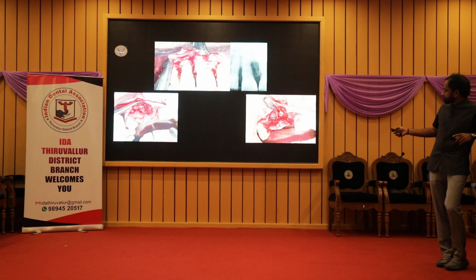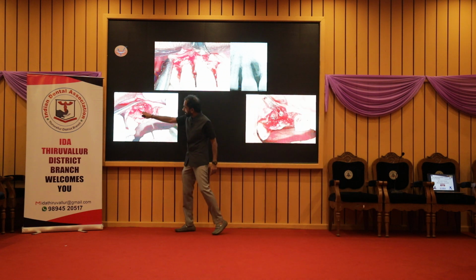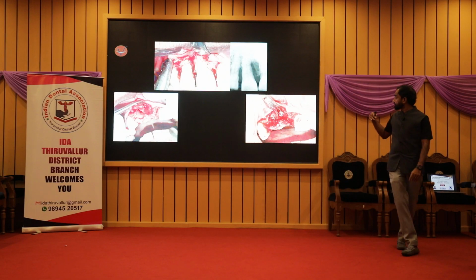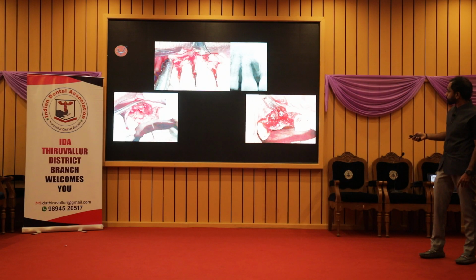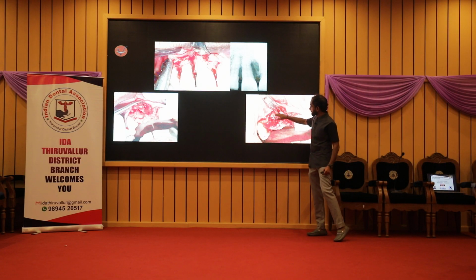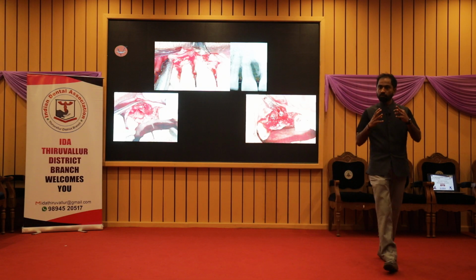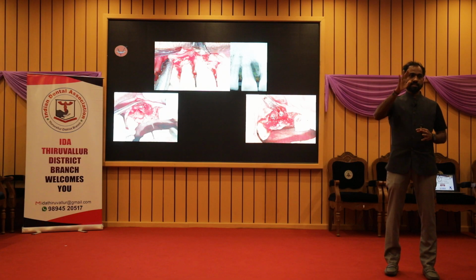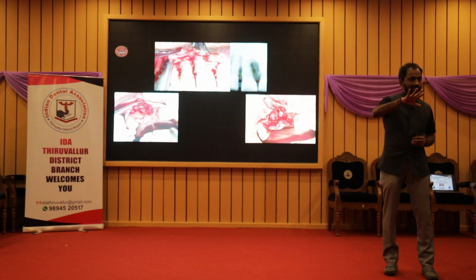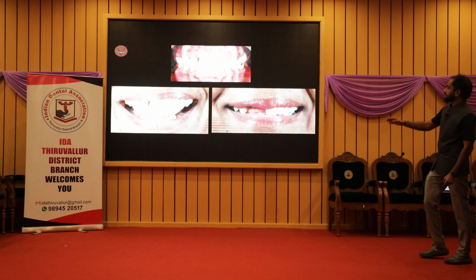Yeah, so this is the X-ray. You can see that a lot of labial bone is lost, all the crestal bone, interdental bone, everything is lost, and this is not very clear. You can see that here some of the threads are exposed, but you have a pocket. If you have a cavity kind of thing, the graft will always stay there, rather than just placing it on the surface, where it might not stay. But if you have a concavity, there is always a chance that the graft will stay there and will pick up. Yeah, so that was there.